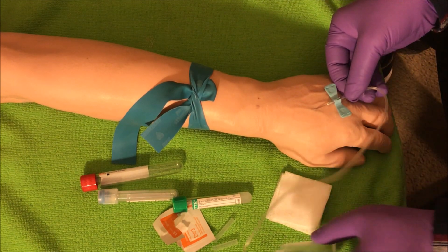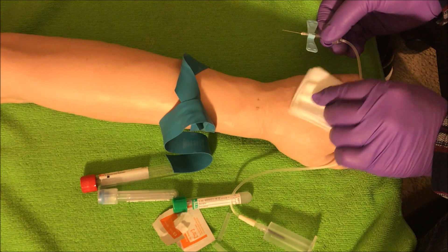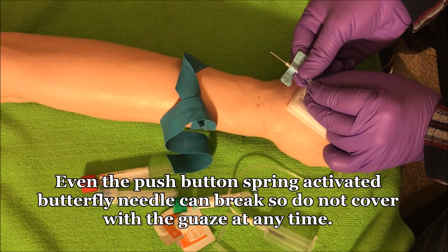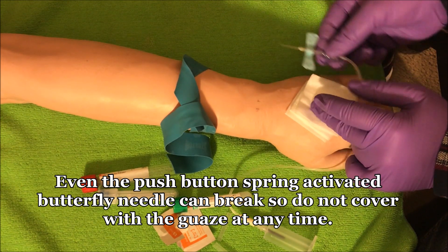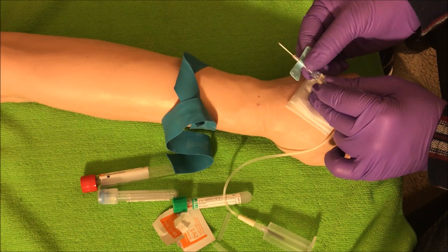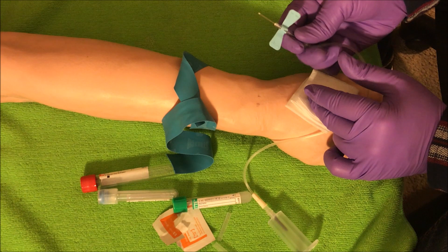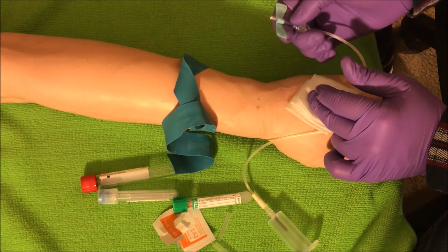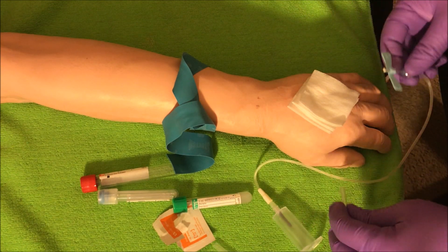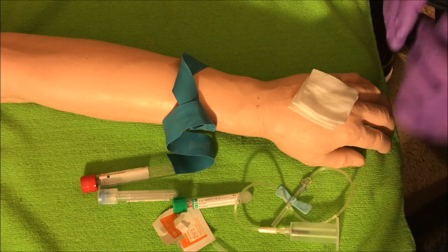Once done, pop the tourniquet off, take my two-by-two, come to the side, and remove the needle the same way as with the straight needle — out and away. This butterfly needle has a different safety device: there are triggers on the side that I have to pinch and then slide up, locking the needle over the device so it doesn't move. Older butterflies just slid right up. Different butterflies have different mechanisms, so you have to get a feel for which type you're using, as not all butterflies are the same.